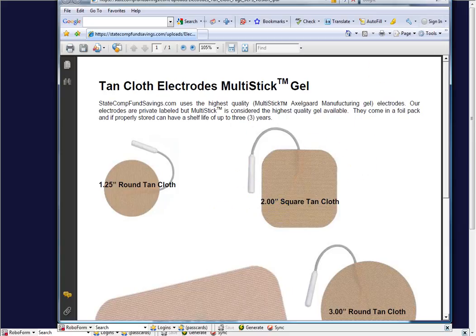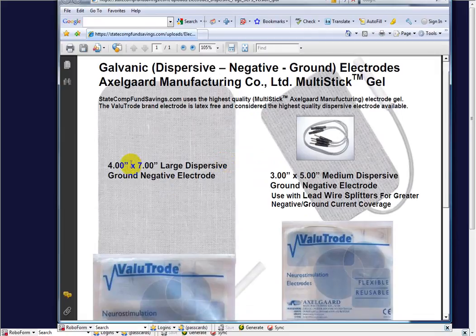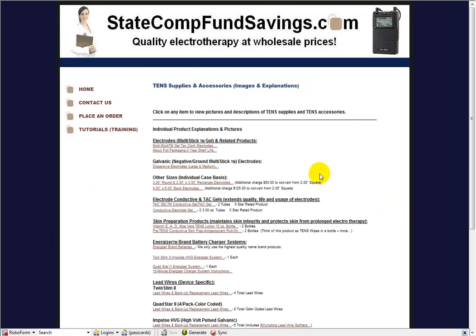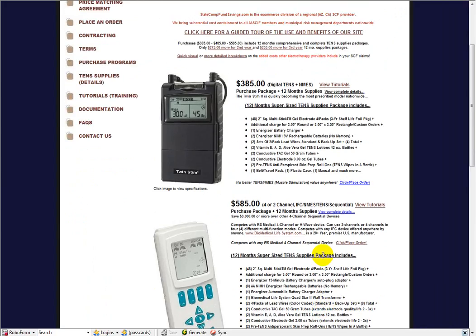The two red active treatment electrode lead wires were connected to electrodes on each side of the stump — on a fleshy area — delivering the active treatment current. Then the dispersive or ground electrode with the black tip lead wire was oppositely charged to the treatment. The device saturated the stump with the pre-programmed polarity for the active leads in the polarity to reduce edema, and the ground was the opposite, causing all the fluid to migrate from the stump up the leg to exit.